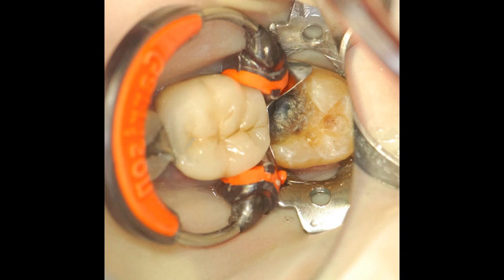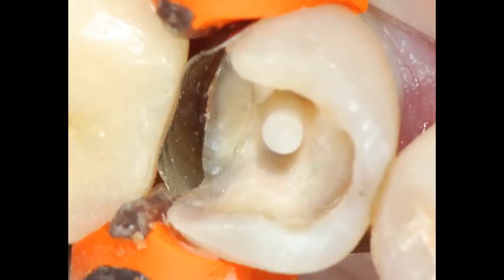With larger lesions, it's often impossible to place the separating ring. When the ring is seated, it often crushes the matrix band into the box. Even with conservative preparations, the separating ring will regularly pinch the matrix band or push it against the adjacent tooth.